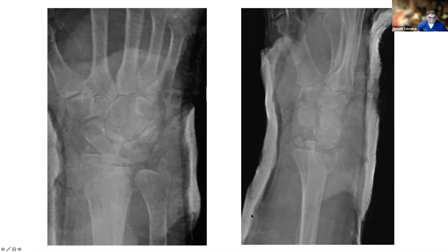Yeah. So just on that, Lindsay, X fixes, I can't remember the last time I put an X fix on versus a spanning plate. X fixes were quite commonly used, bridging and non-bridging, particularly north of the border, Lindsay. What are the advantages of using a spanning plate versus an X fix? What are the risks of an X fix versus a spanning plate?